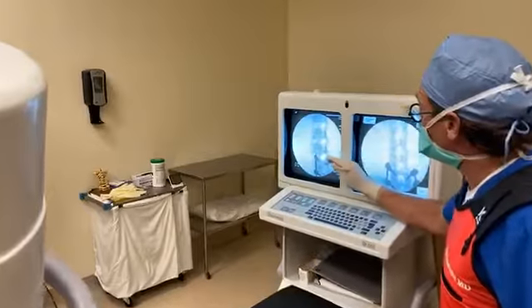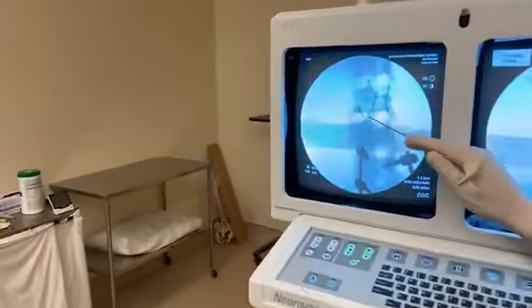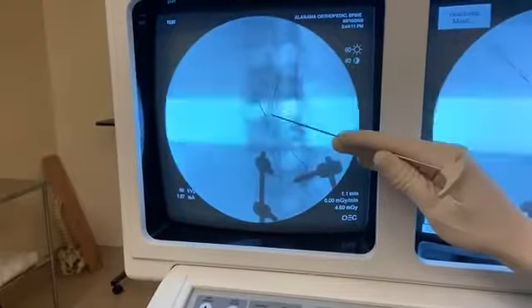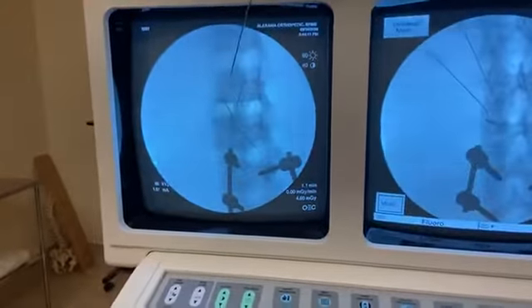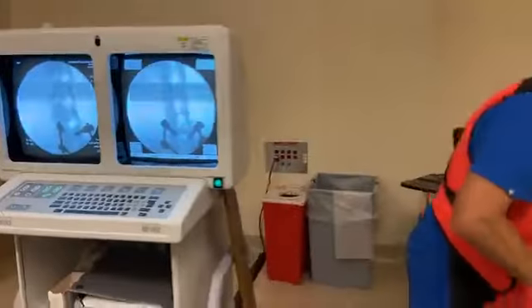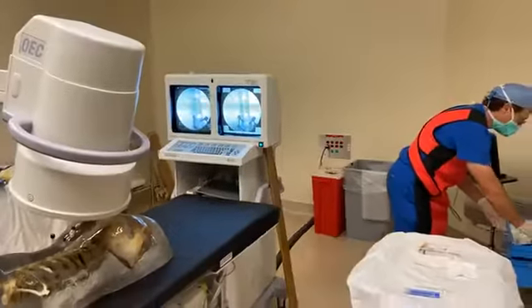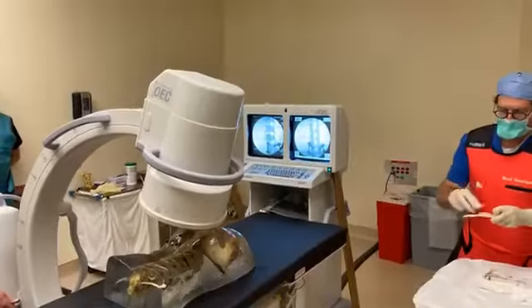Now, this joint is innervated by a nerve just at the level of that joint. That's this needle here. But there's also a nerve called the medial branch here that innervates the joint. So I'm going to get another needle out. Sorry, y'all. Should have done that before. But then I can also demonstrate really the technique.